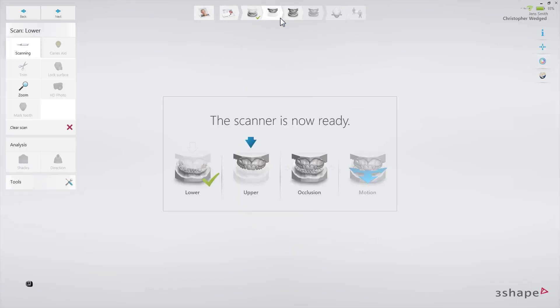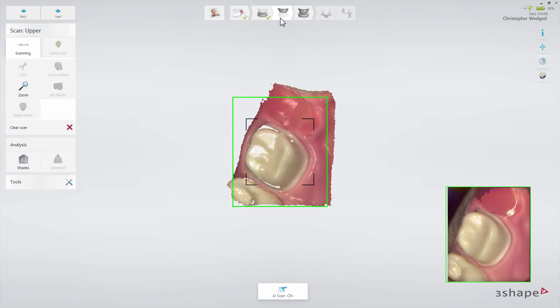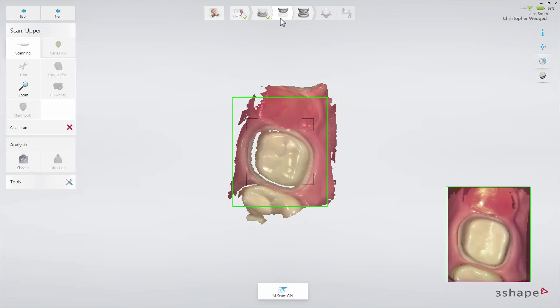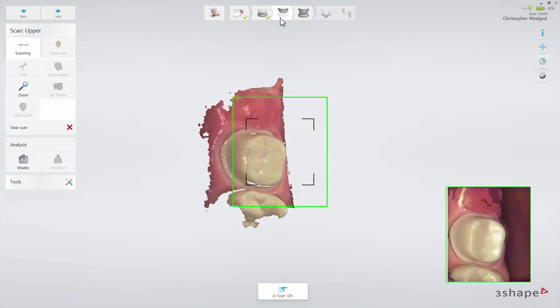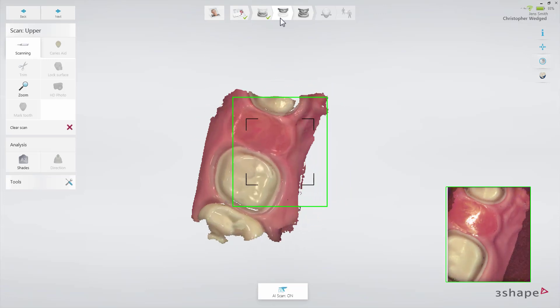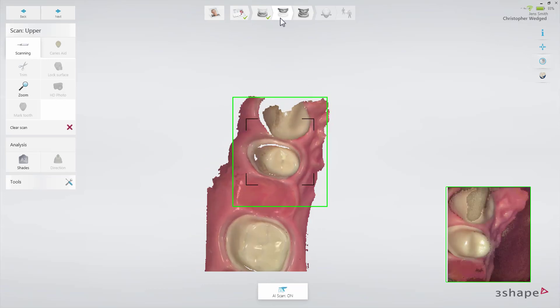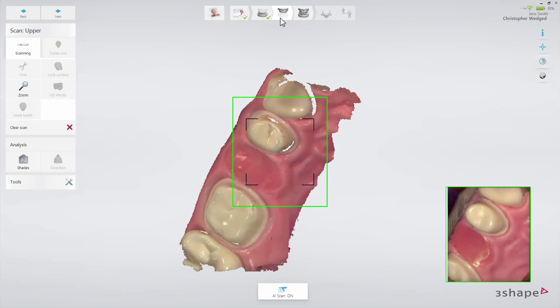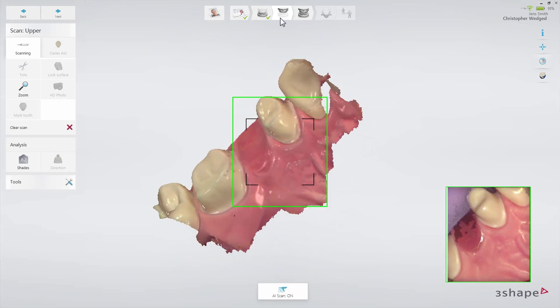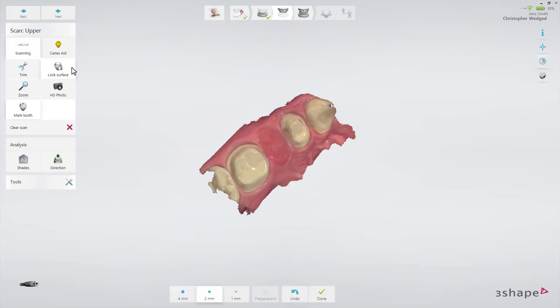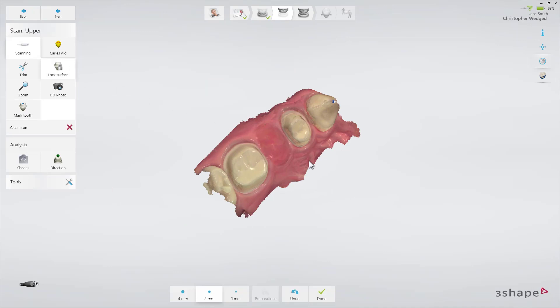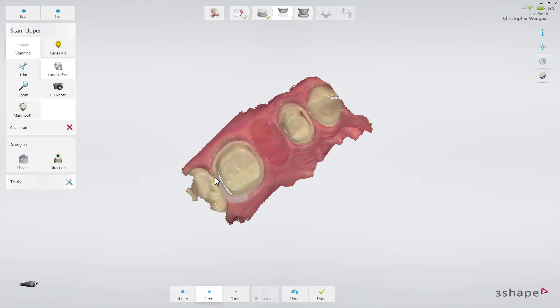Now proceed to the upper arch and scan the same area as in the lower arch. There are two ways to scan the arch with the preparation. The first option is to remove the retraction cord, dry the preparation, and scan the preparation with the clear margin immediately, before the gingiva collapses. Make sure to cover the margin well. Then, paint the margin using the lock tool. This will freeze the margin in its current retracted state, thus preventing it from being updated with later data when the gingiva might have collapsed.